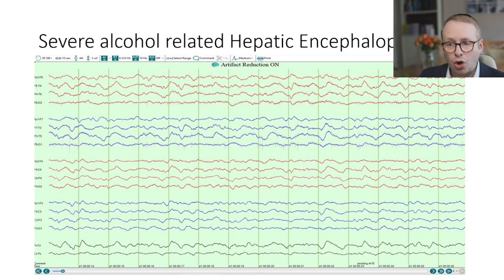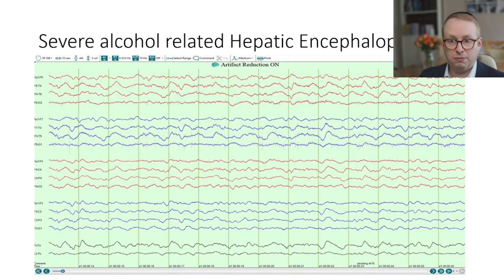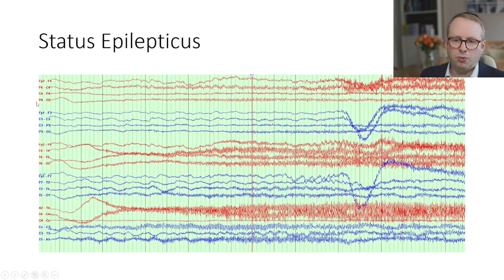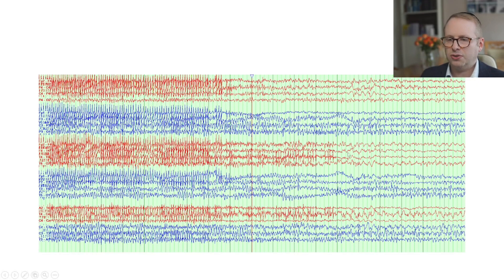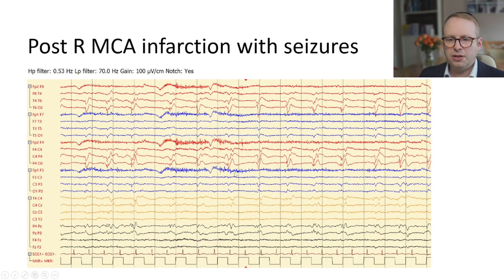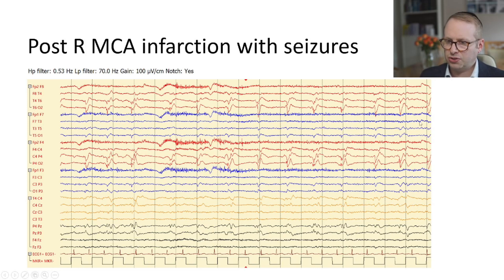This is someone who has got severe alcohol-related hepatic encephalopathy. The liver has been very dysfunctional, which ends up with the brain being dysfunctional for a variety of complex reasons, giving this patient a depressed level of consciousness. This is status epilepticus — you can see a buildup of rapid fast activity which spreads across the brain, establishes itself, and then eventually settles down. We then have the postictal phase where the EEG flattens and the brain is quite dysfunctional in the period thereafter. This is someone who has had a stroke and seizures as a result — you can see these complex periodic discharges which are reflective of an irritable brain in this region following the stroke.